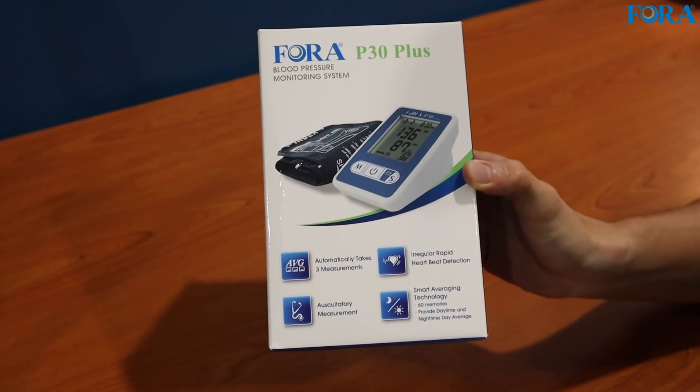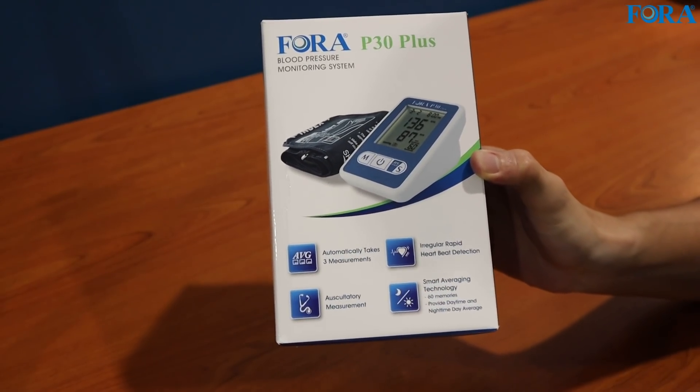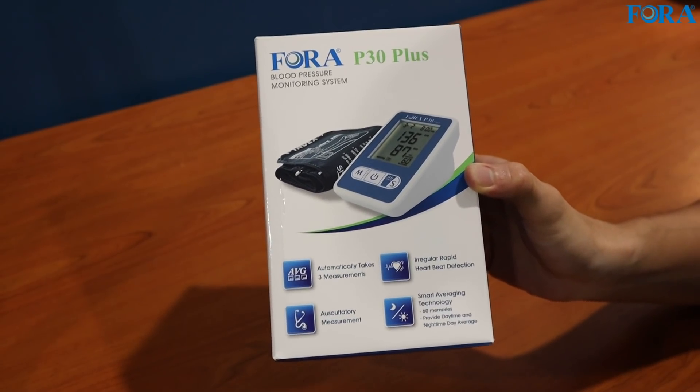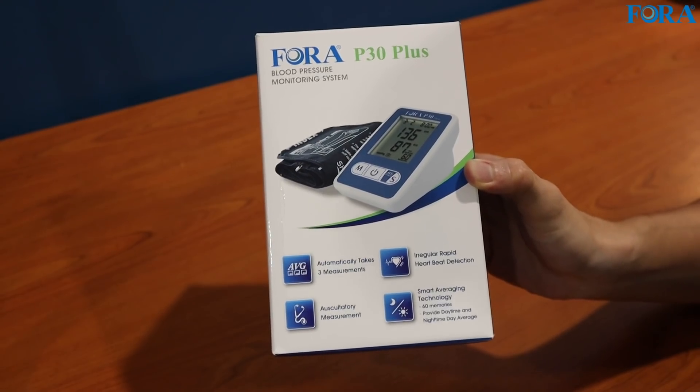Let's look at some features listed at the front of the box. Number one, it automatically takes three measurements, so it will do the average of your reading for you. You don't have to manually record three times and then calculate the average — everything is done for you.